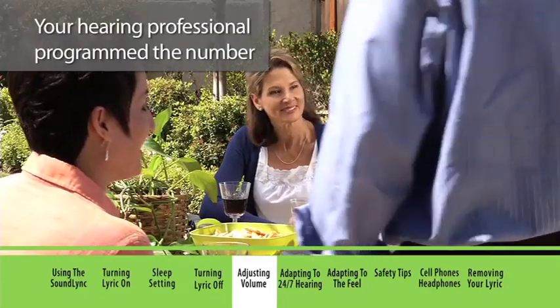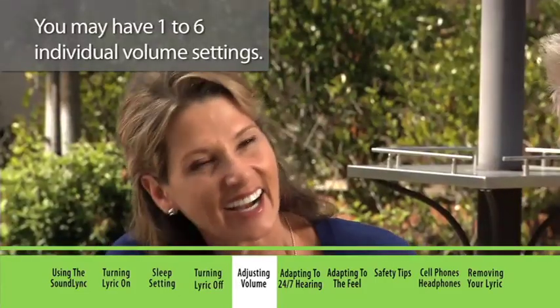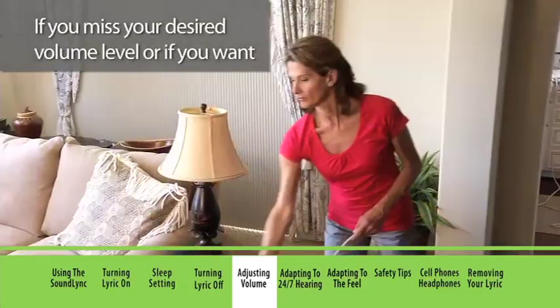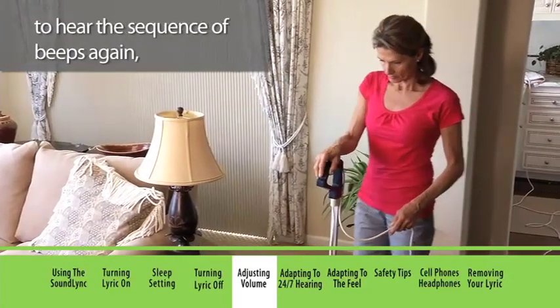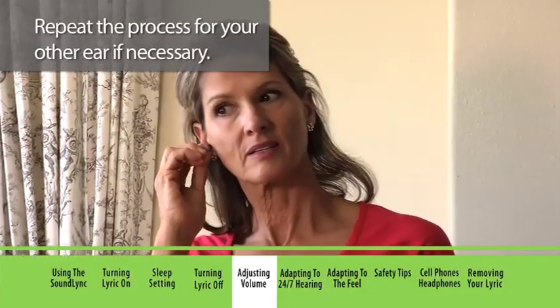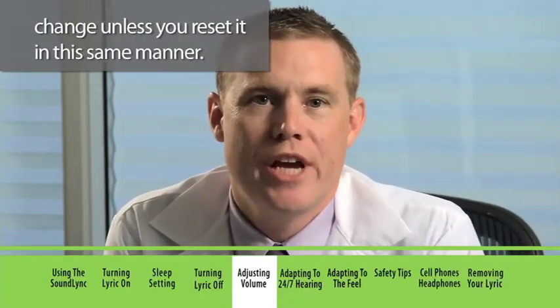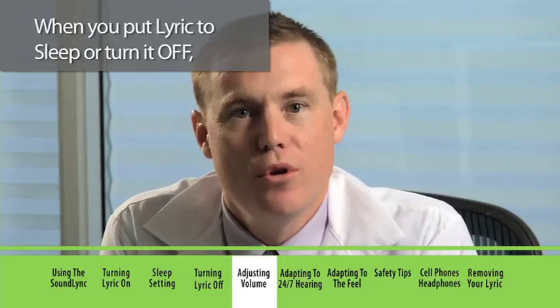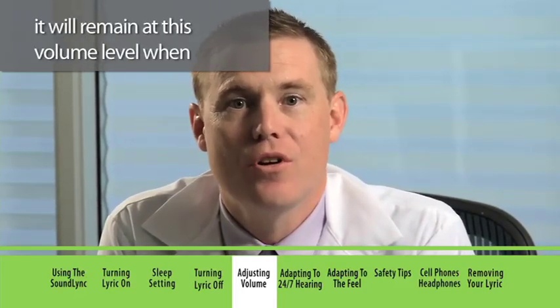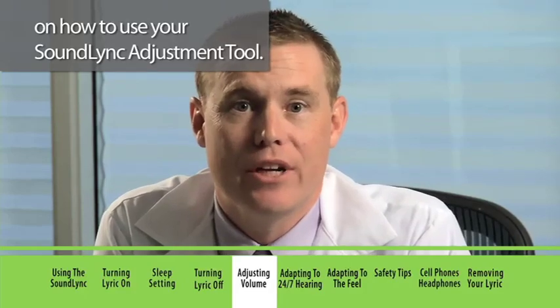Your hearing professional programmed the number of volume settings for your specific hearing needs. You may have one to six individual volume settings. The volume beeps allow you to pick the volume level that works best for you at any particular time. If you miss your desired volume level, just leave the SoundLync in place and it will cycle through the volume beeps again. Remove the SoundLync each time you reach the desired volume level, and repeat the process for your other ear if necessary. Your Lyric volume level is now set and won't change unless you reset it. See your user manual for step-by-step instructions on how to use your SoundLync adjustment tool.